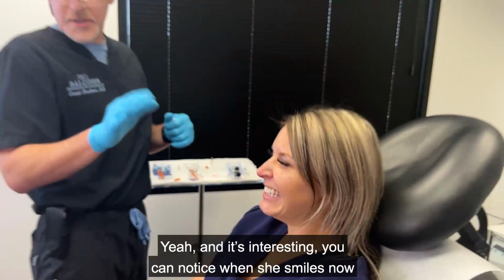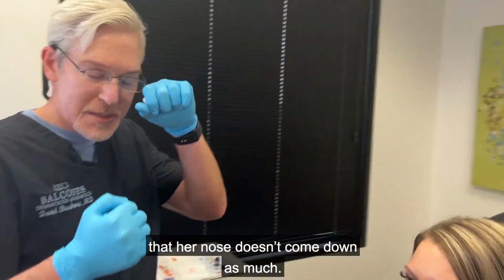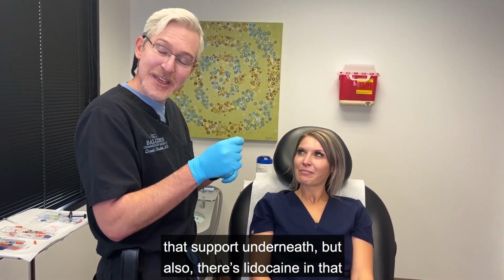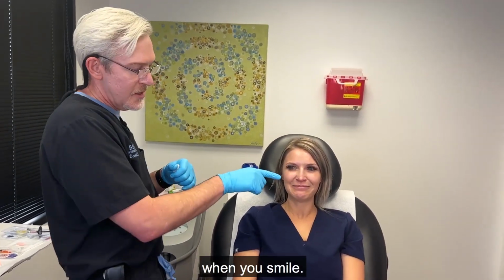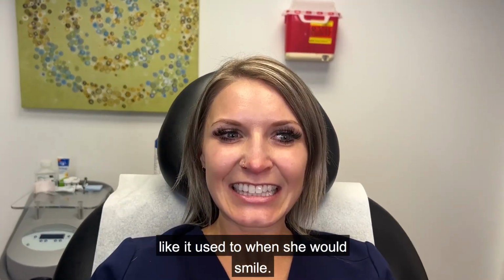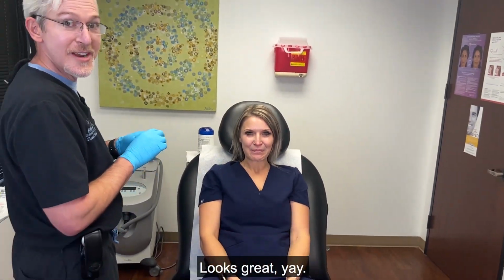Yeah, and it's interesting, you can notice when she smiles now that her nose doesn't come down as much. Partly that's because I put that support underneath, but also there's lidocaine in that, and so that kind of numbs that little muscle that pulls down when you smile. So you can watch, just relax and then smile. You can see her nose doesn't drop down anymore like it used to when she would smile. So, looks great. Yay.